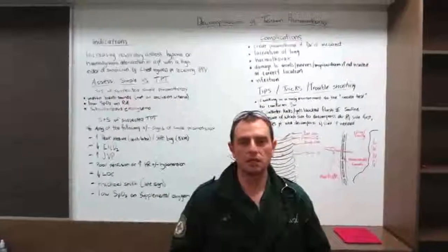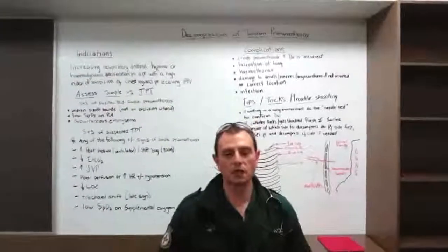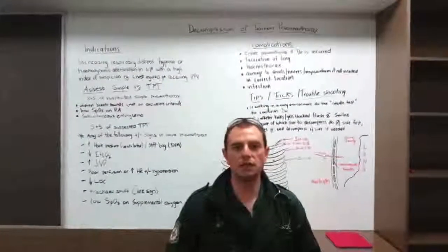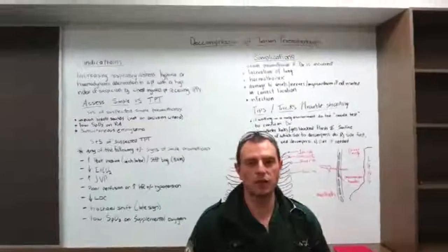Hi, Seth again. I'm going to take you through decompressing a suspected tension pneumothorax. What that means is basically inserting a needle into the pleural space to let some of the trapped gas out and hopefully reinflate the lung.